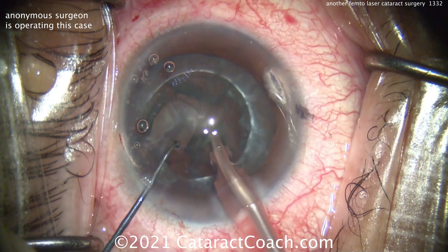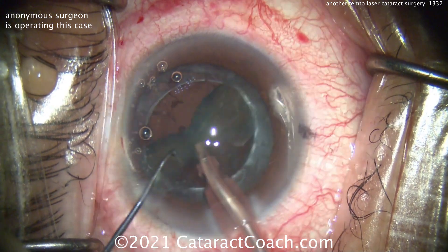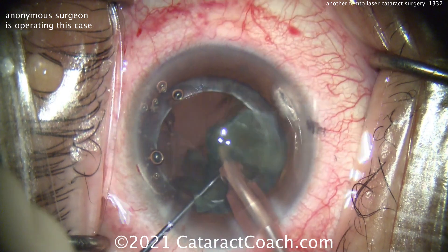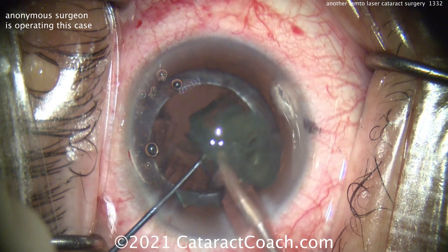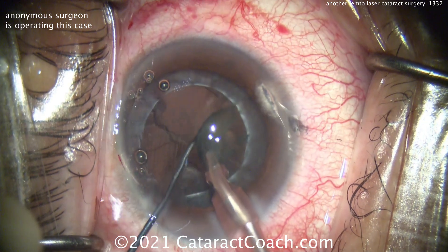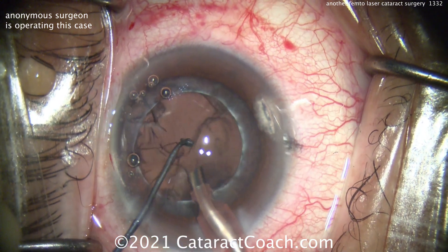Looks pretty good. I do like the draping in this case, and I do like the eye staying in primary — this is obviously a very talented surgeon. Removing the rest of the nucleus, chopper going in that safe position just to keep the posterior capsule at bay. And that looks pretty good.